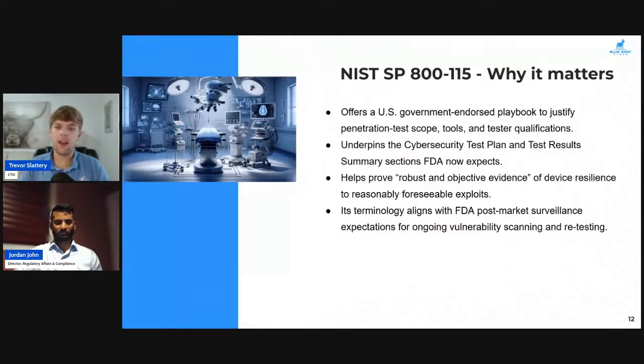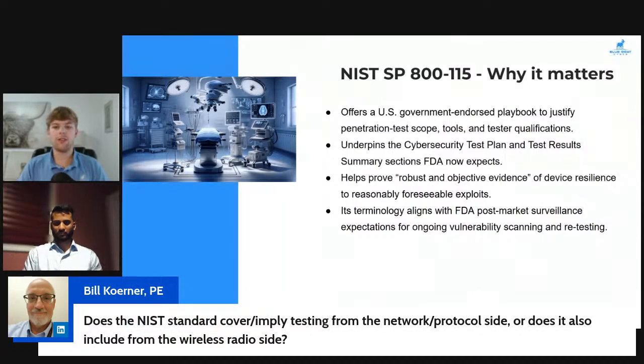All right, does the NIST standard cover or imply testing from the network protocol side? Does it also include from the wireless radio side? So there are NIST standards that are going to cover just about everything. What we're looking at with 800-115 is essentially what that secure testing process looks like, how we're planning it out, how we're moving into the execution phase on developing these test cases, developing the test report after the fact. For the process, it's going to be very similar if we're handling wireless radio. So this will be communications, Wi-Fi, Bluetooth, RFID, things like that. Well, I guess RFID is going to be wireless magnetic, but the point still stands.